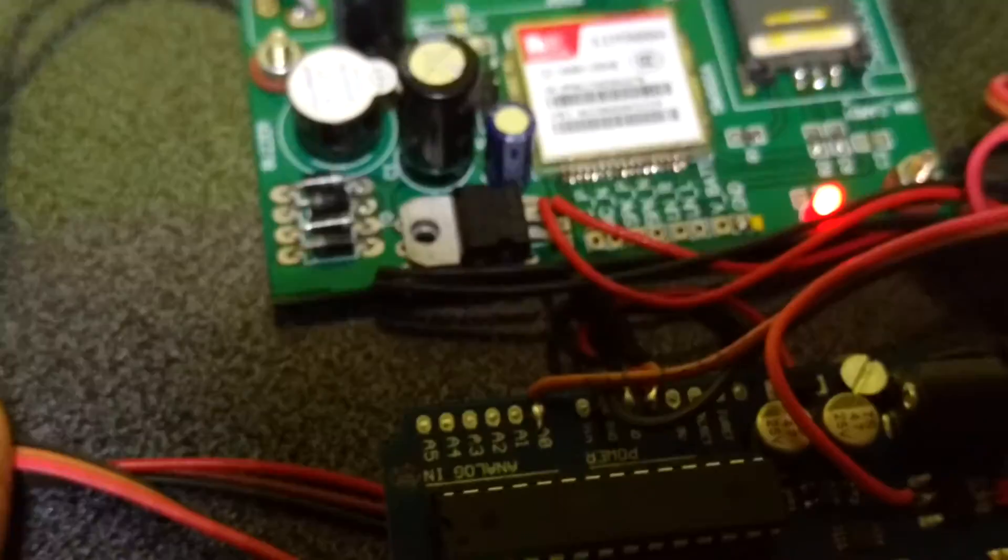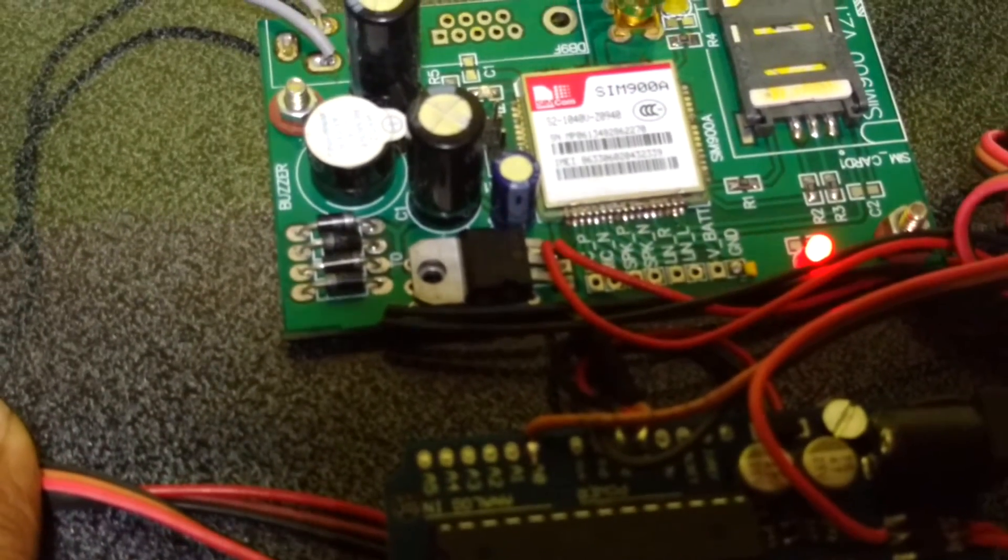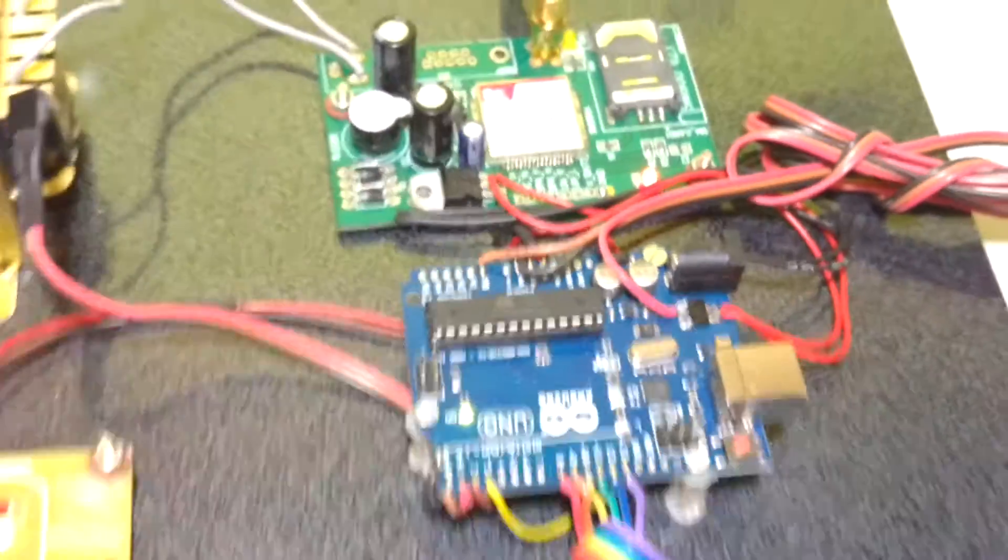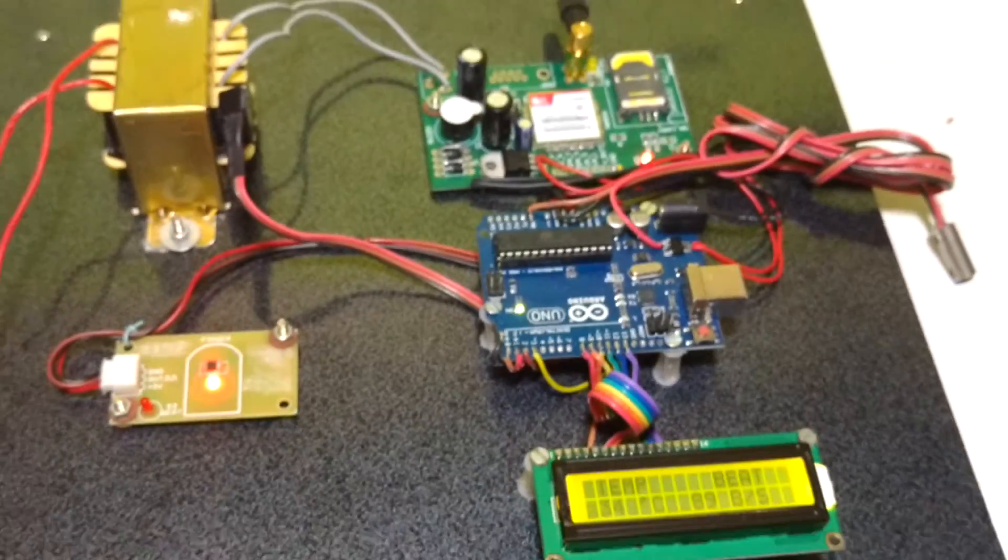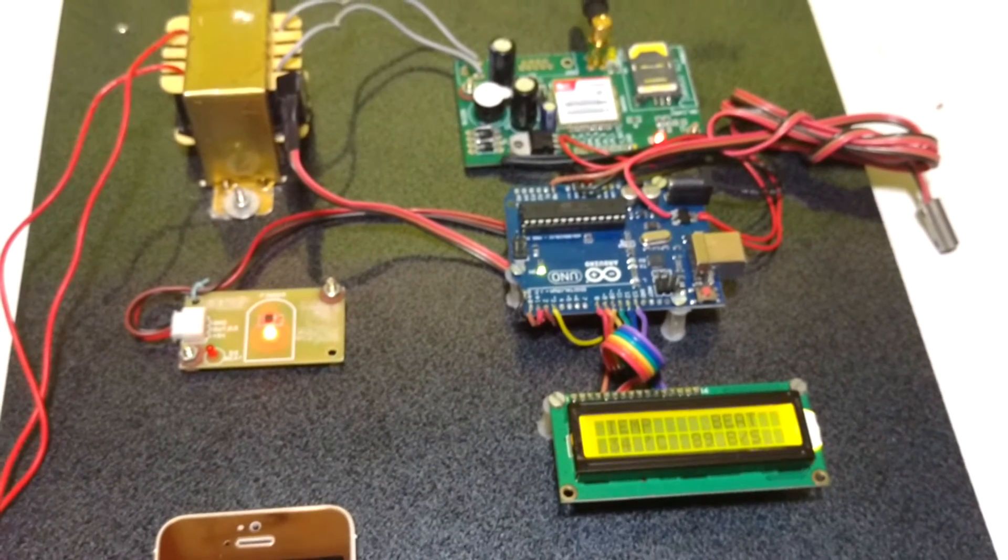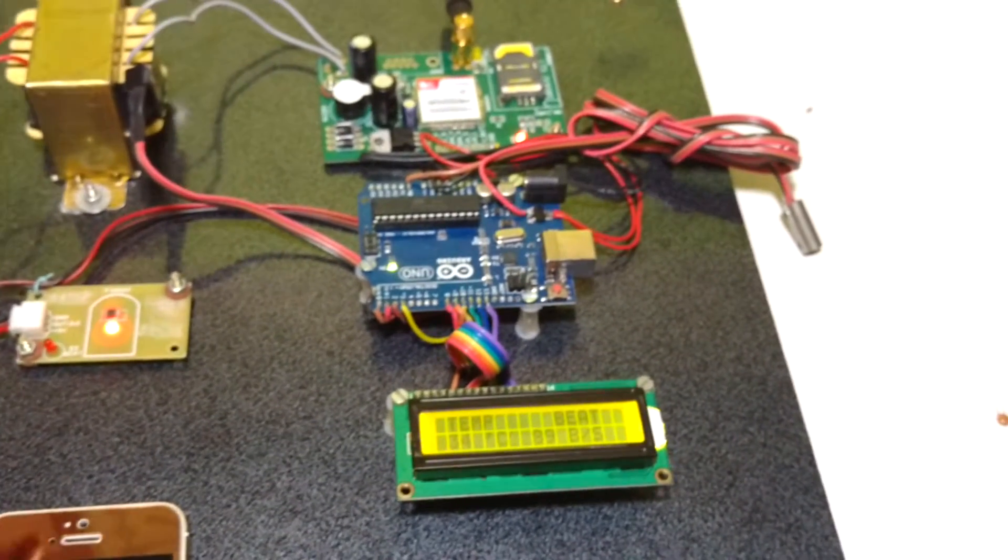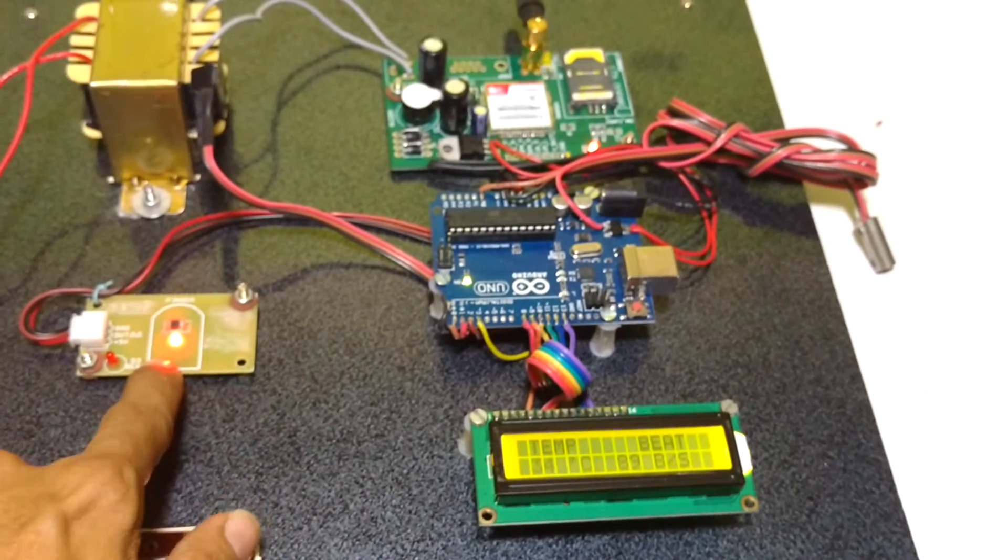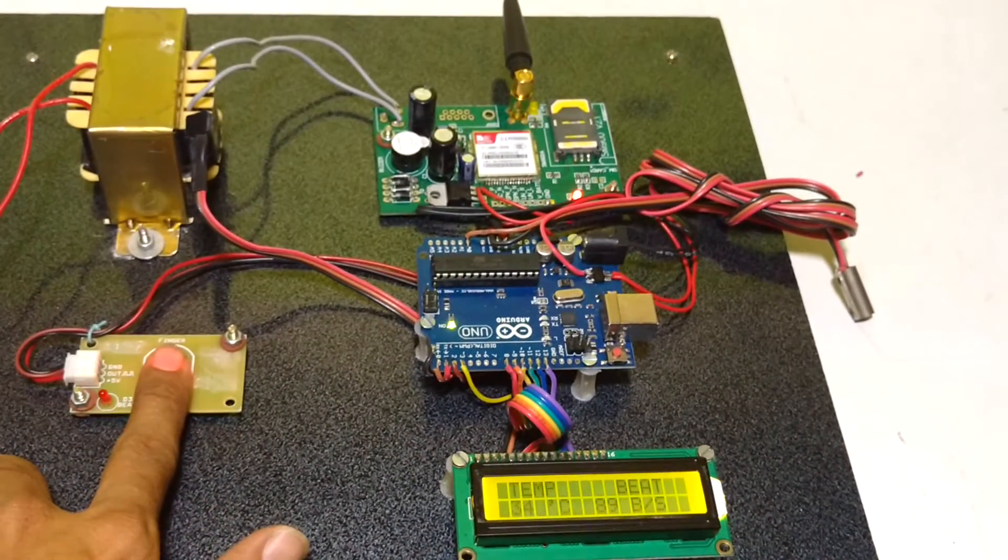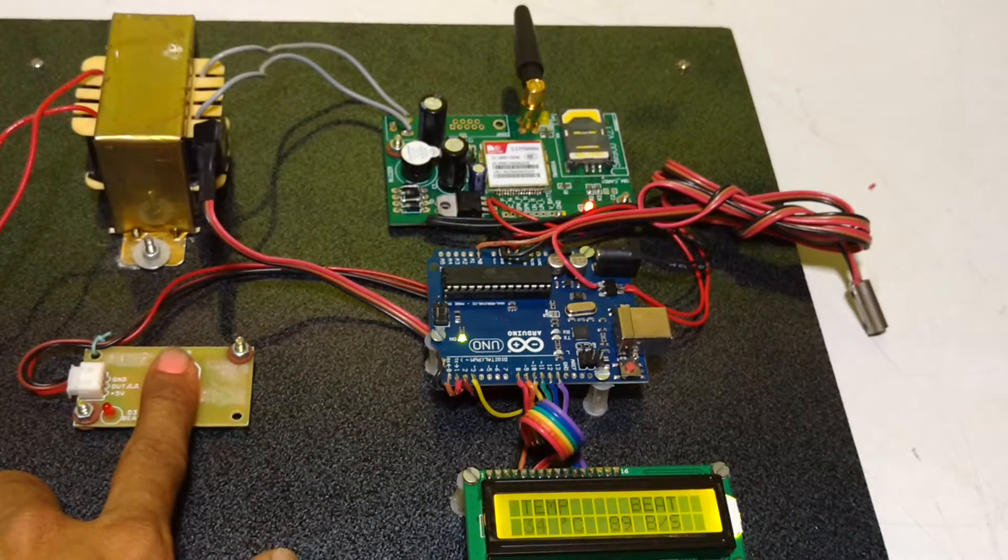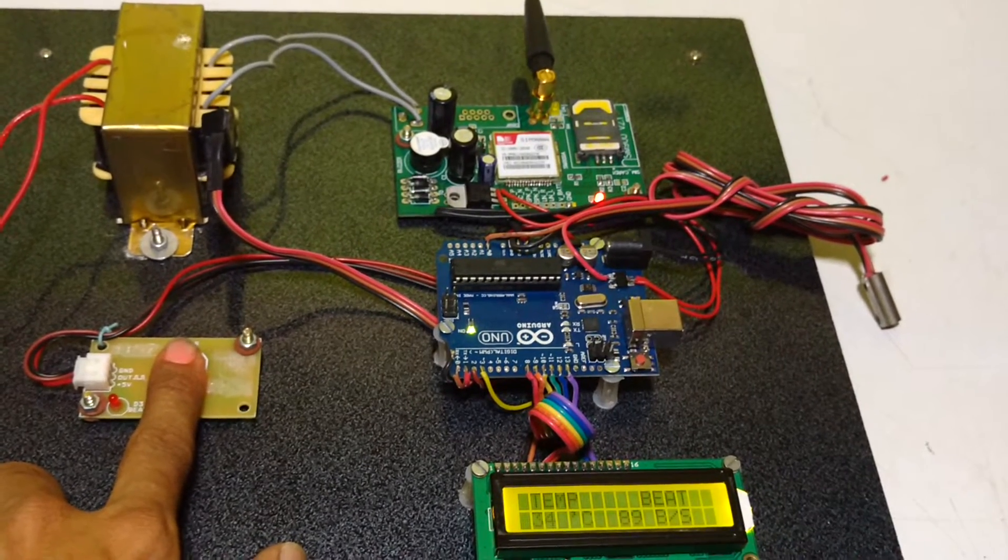Then the supply will be regulated with help of 7805, a voltage regulator. We have used two sensors here. One is heartbeat sensor which detects pulses of heart through our vein.